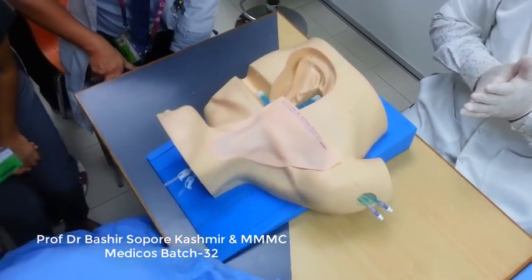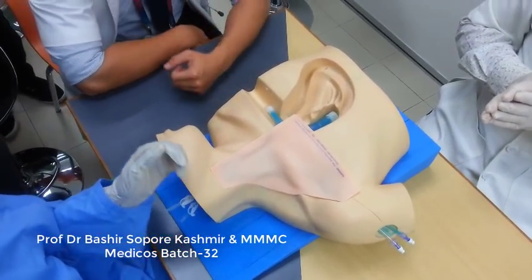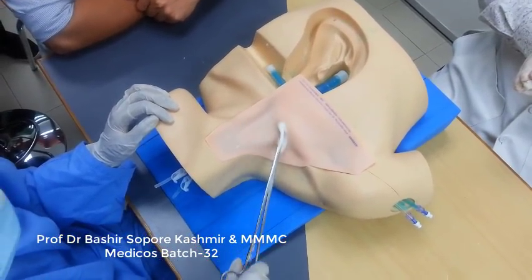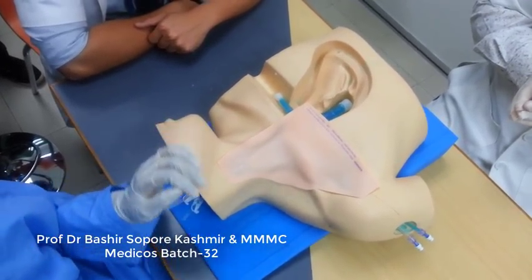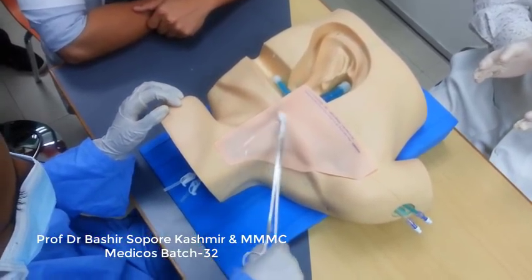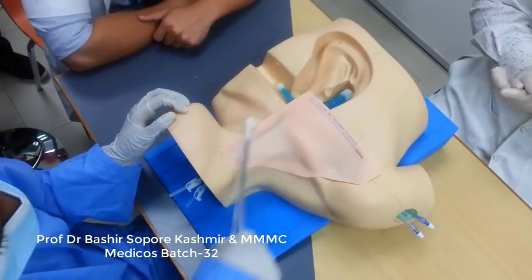You will soak the gauze with the chlorhexidine, then start cleaning from inwards to outwards, and a large area is to be cleaned. You can clean it 1 time, 2 times, or 3 times, for 1 or 2 minutes, till you are satisfied that everything is cleaned properly.